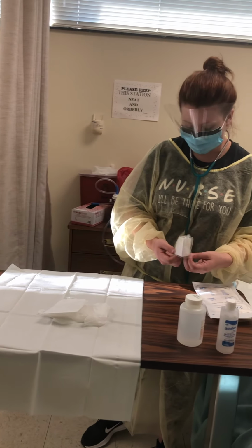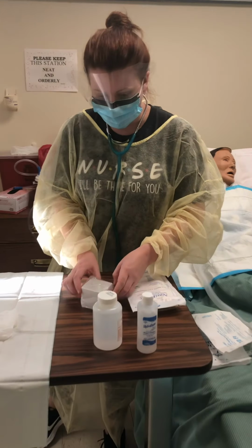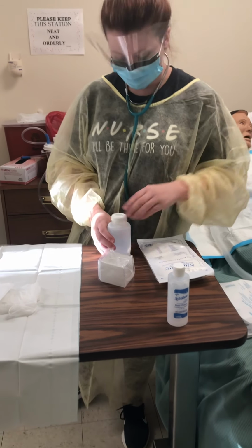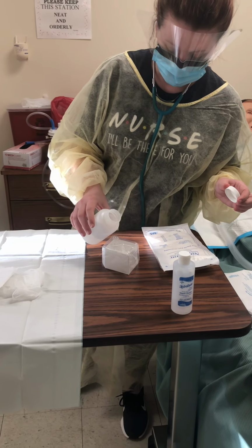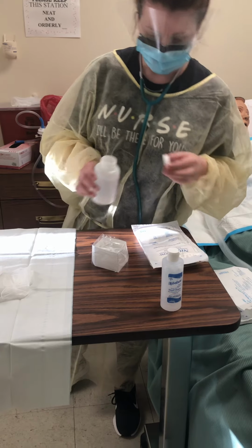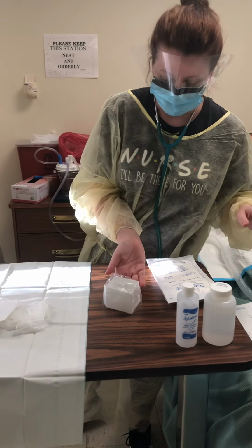And I'm going to set that up for my sterile water. And the sterile water is brand new. Okay, so I've got that ready.